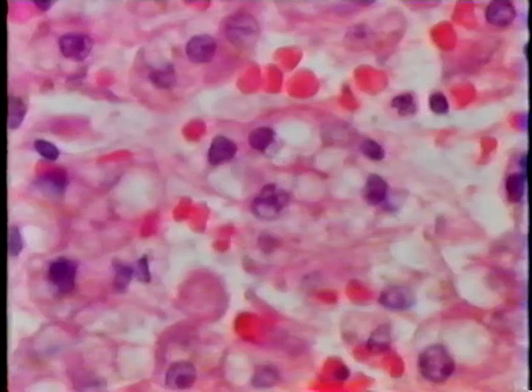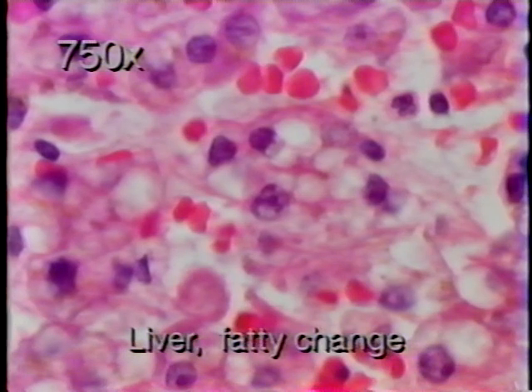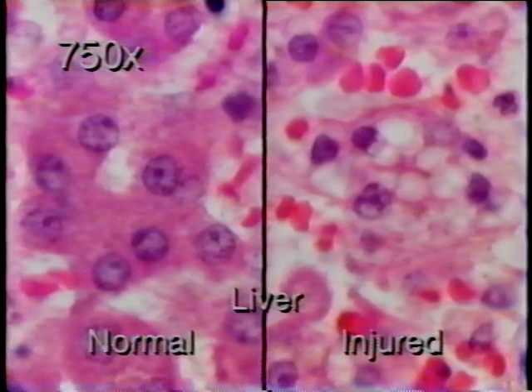In cells such as these, you see several smaller, clear vacuoles. Notice that the hepatocyte nucleus is still round and not yet flattened against the cell membrane. This represents an earlier stage of fatty change. With progressive fat accumulation, the smaller droplets would coalesce into larger globules and compress the intracellular contents against the cell wall. Now examine the section of normal liver on the left and compare it with the section on the right, in which small fat globules are contained in the hepatocyte.